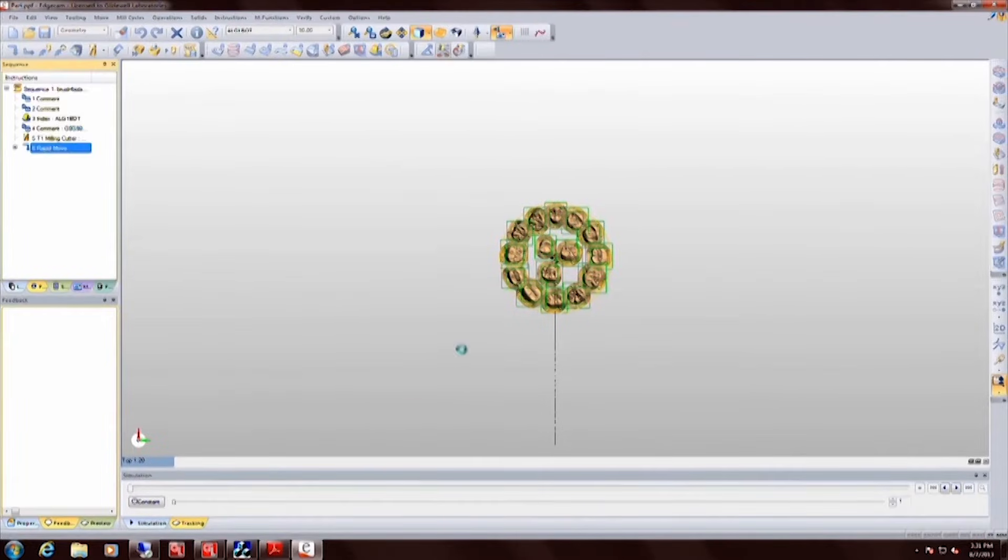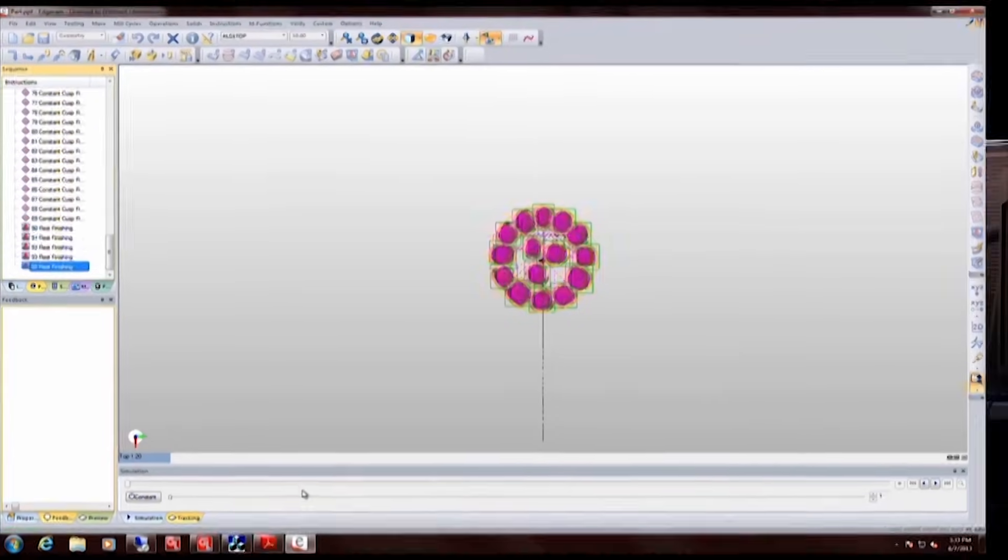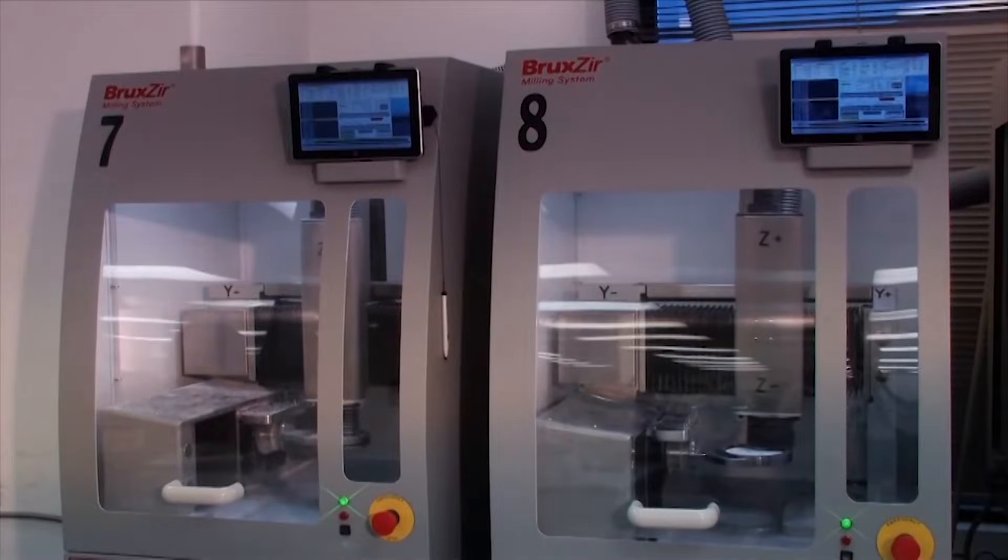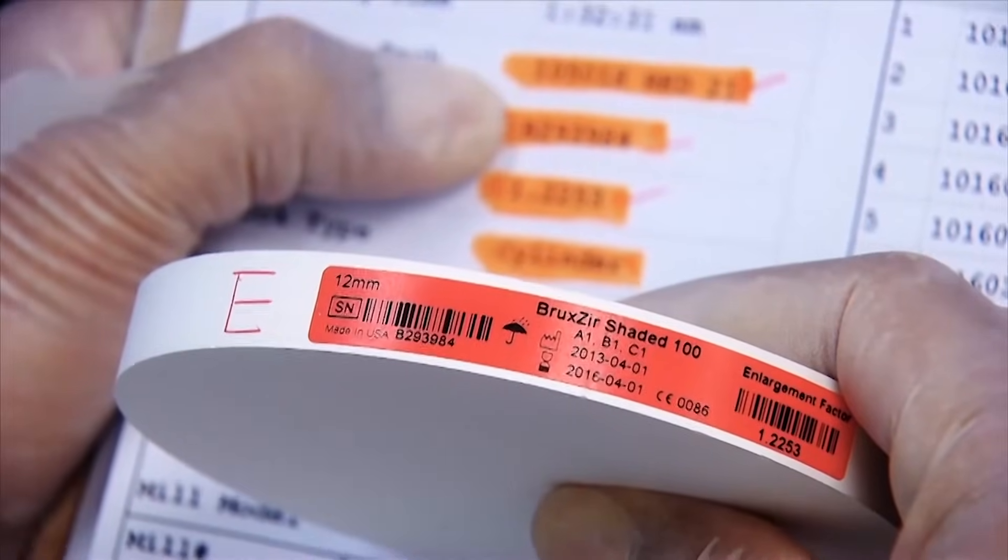You can see that the different crown designs here are all being nested. These are all going to be A2 crowns, for example. And so unlike Emacs, which is milled in a small block, Bruxer crowns are milled from a big white hockey puck. So we do a bunch of shades, a bunch of crowns at the same time.